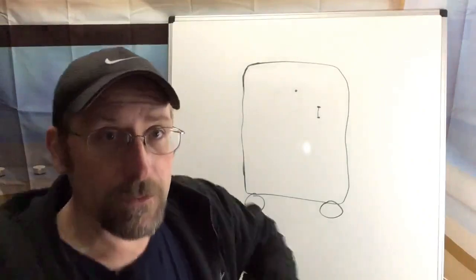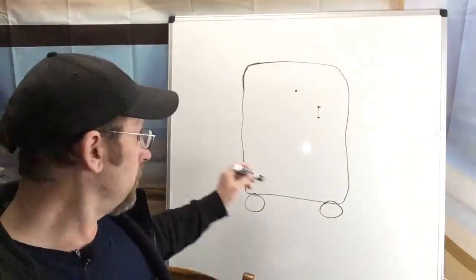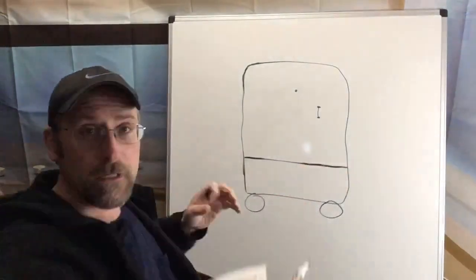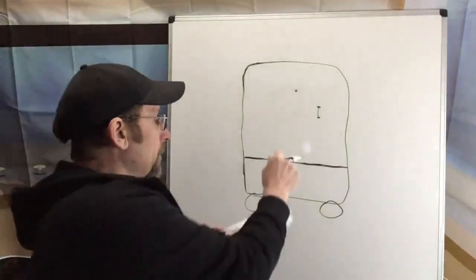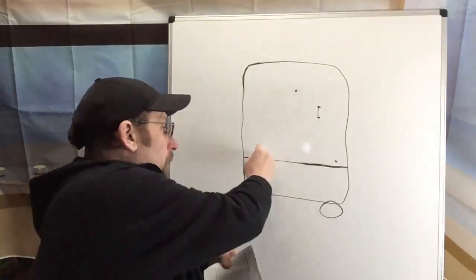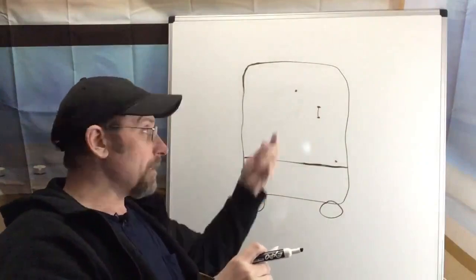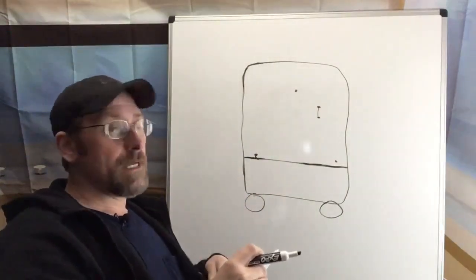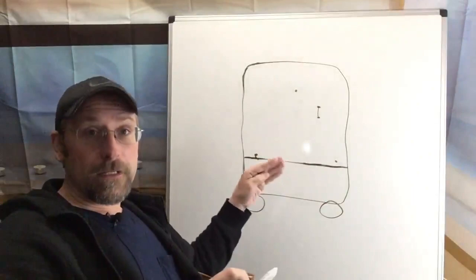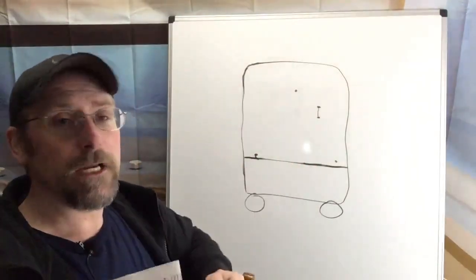So basically, right from the start, one of the worst things you can have go wrong with the machine is, like here with the case, where the case attaches with like an Invacare 5. They're the most problematic because of their age that I've dealt with. And going around the case, there's screws. It goes into the case, but unfortunately, at times, the parts of the case are broken, so the machine isn't attached as tightly as it should be. And there's some Platinum 5s, Platinums, and Platinum 10s that are in that same boat, where the case is cracked or the foam is missing and now it's vibrating against the case. And basically what happens is it starts to make this loud shaking noise.